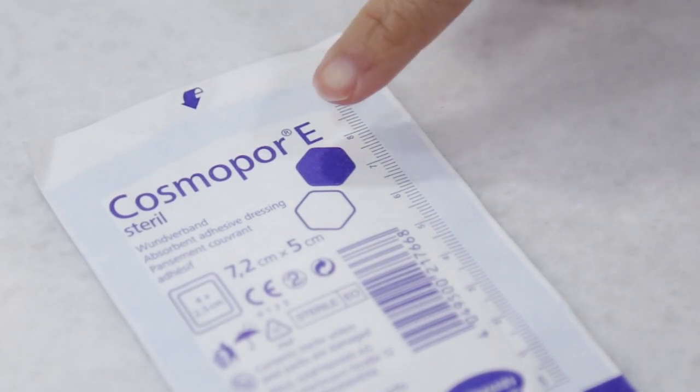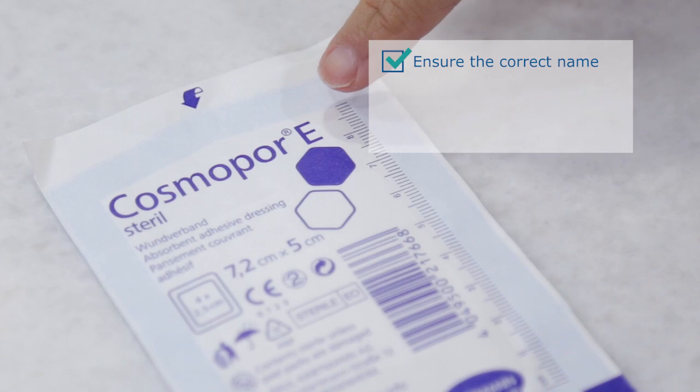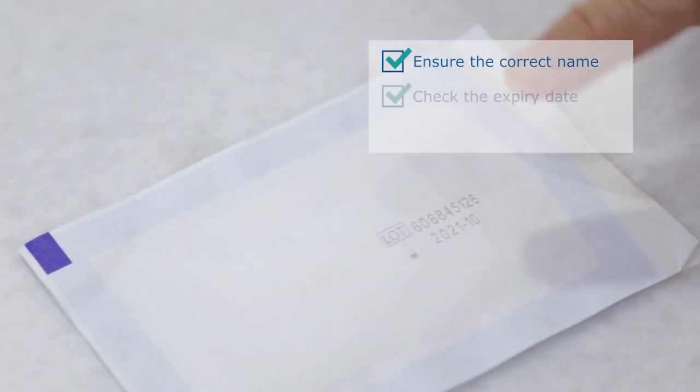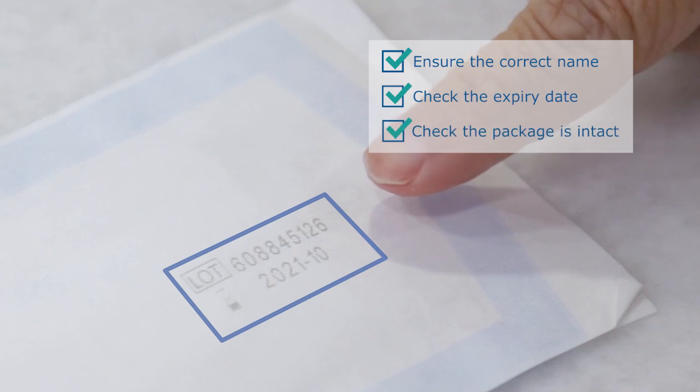Check the dressing supplies too. Ensure the correct name, check the expiry date, and check that the package is intact.